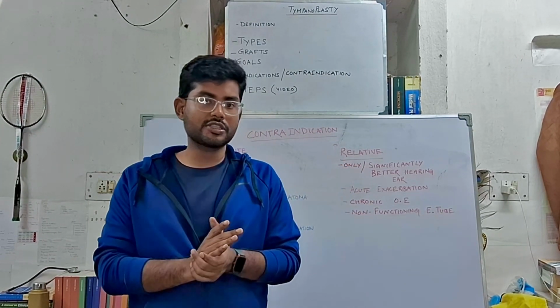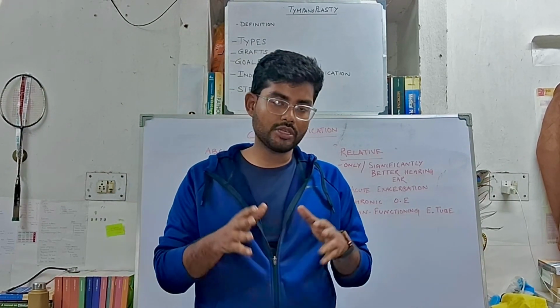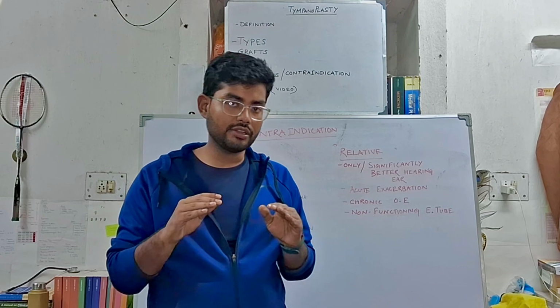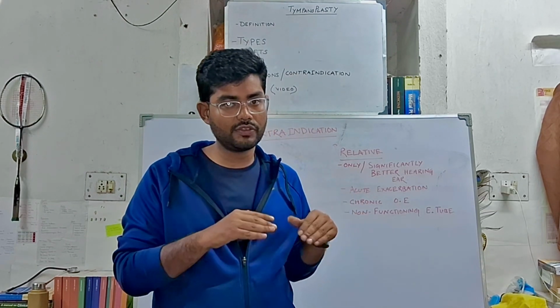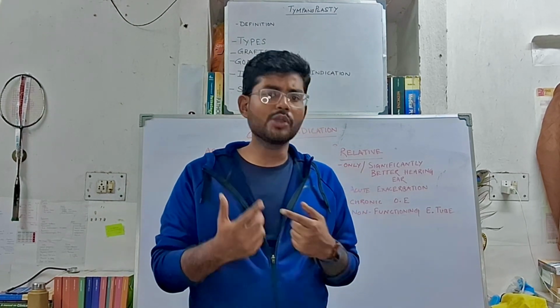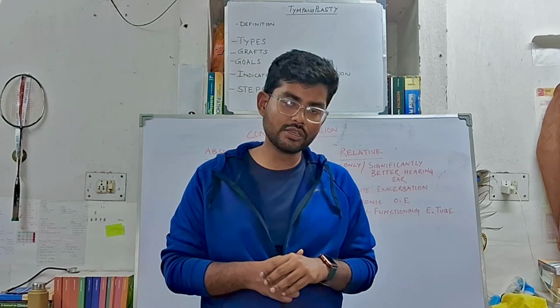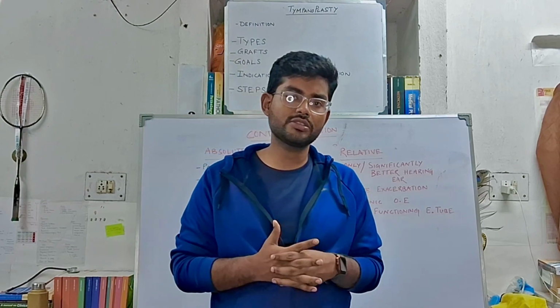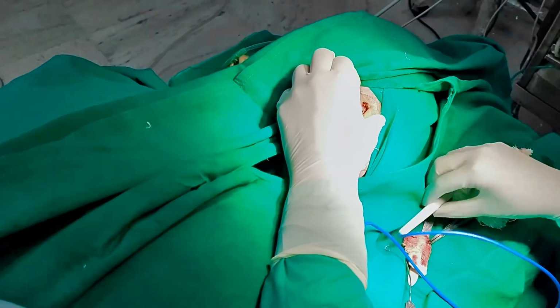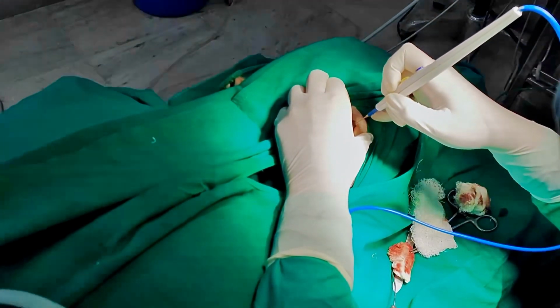Now, I'll try to explain the steps, the positioning of the patient and the uses of the instruments during tympanoplasty in a short video. And this video is only for the level of the third professional part 1 student, because I won't go into the details of the instruments which are required for the proper middle ear work, only the commonly asked instruments. So this video is showing type 1 tympanoplasty by the post-auricular approach.